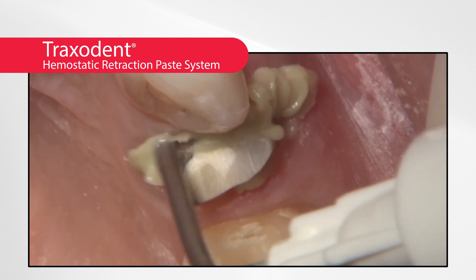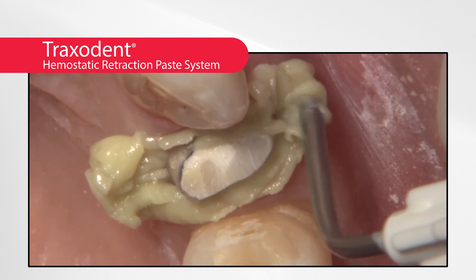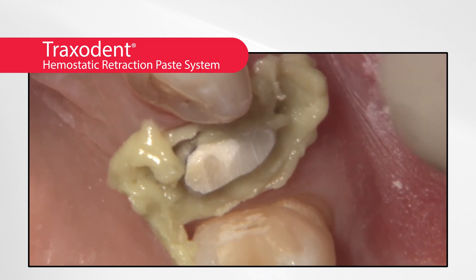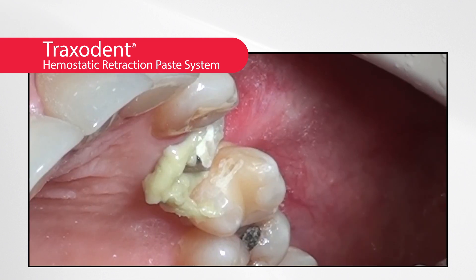Let's look at a quick clinical case. After the preparation is completed, to achieve tissue management for an outstanding final impression, Traxedent is dispensed into the area around the prepared tooth alone or in combination with gingival retraction cord.